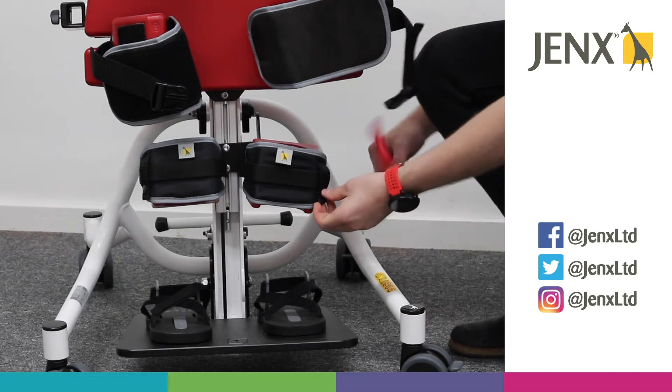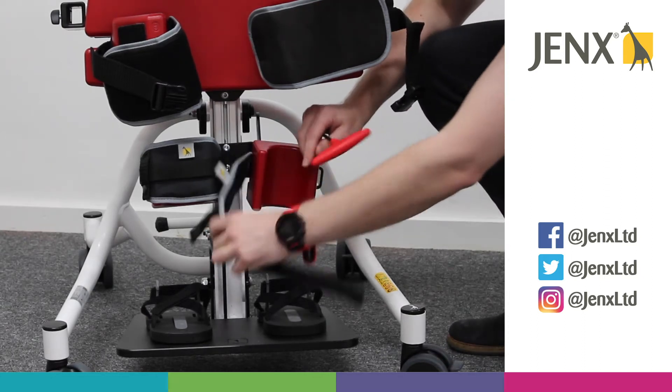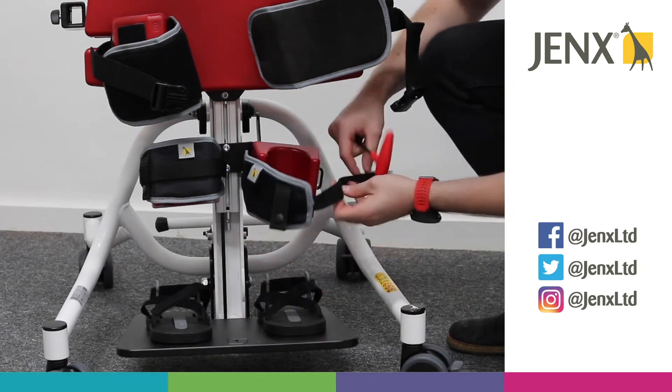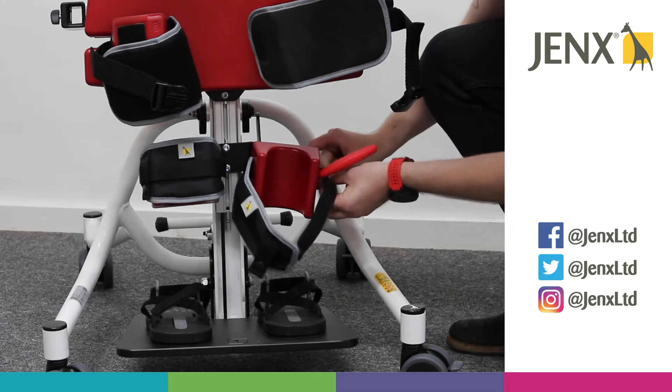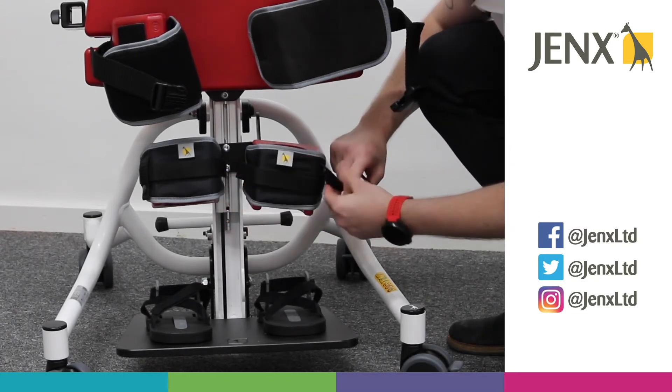Just to show you the straps, we've got one button here and then the Velcro strap here. Release that whilst you're getting into the stander, and then we can pop that over the knee to support the knee in position.